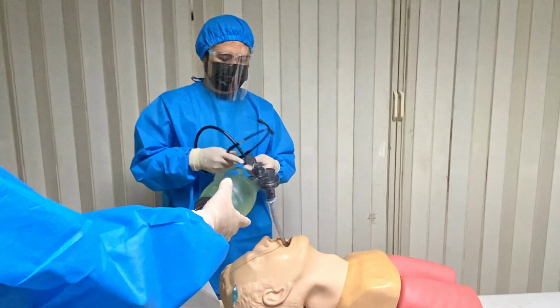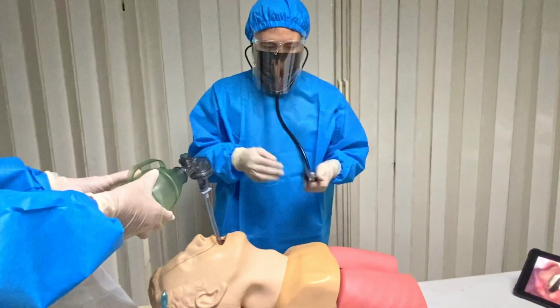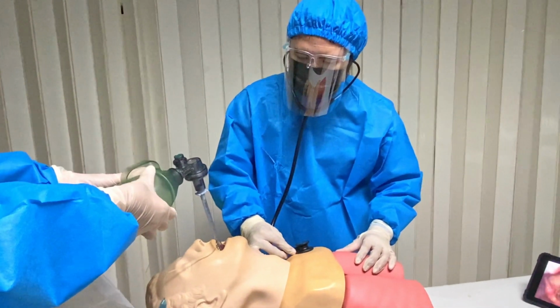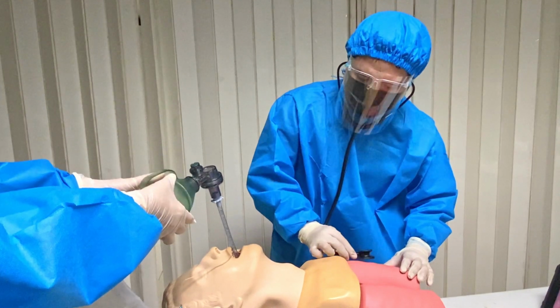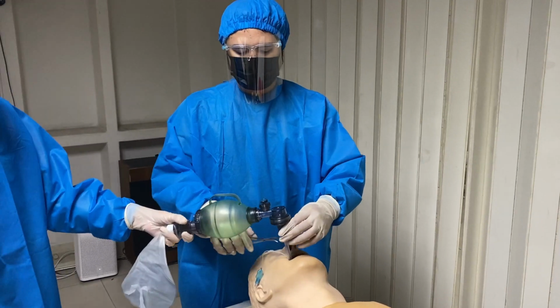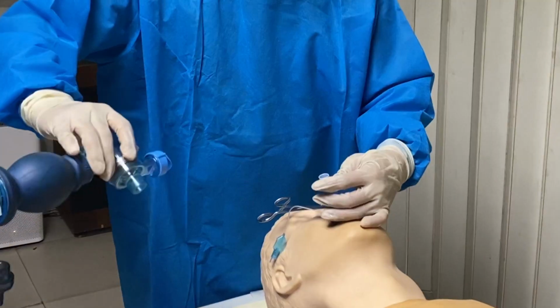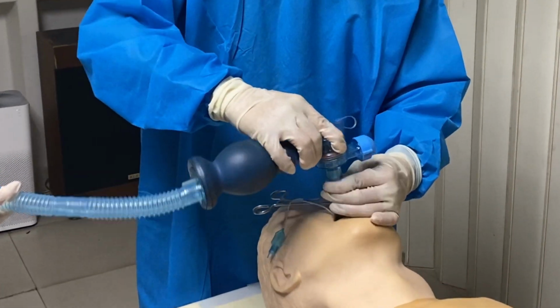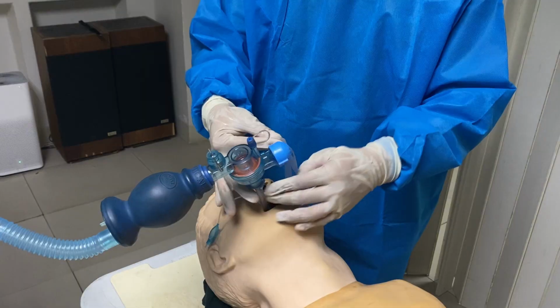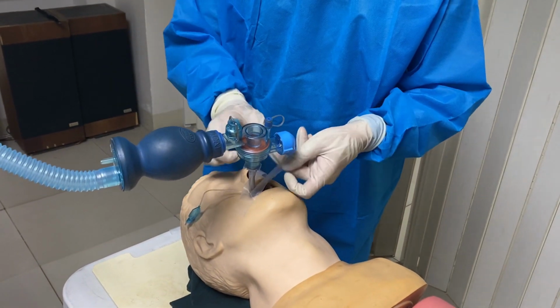Confirm the proper placement of the tube using 5-point auscultation of the lungs and epigastrium. There should be equal breath sounds on both lung fields and absent gurgling in the abdomen. As a COVID precaution, clamp the tube before removing the bag. Attach it to an oxygen source. Secure the tube with plaster to avoid accidental repositioning or extubation.